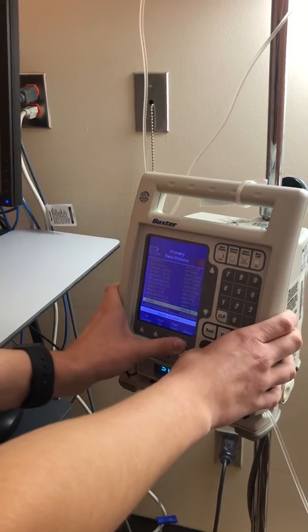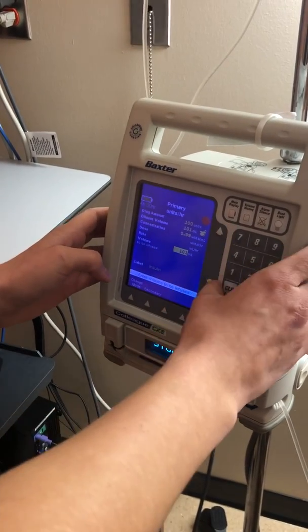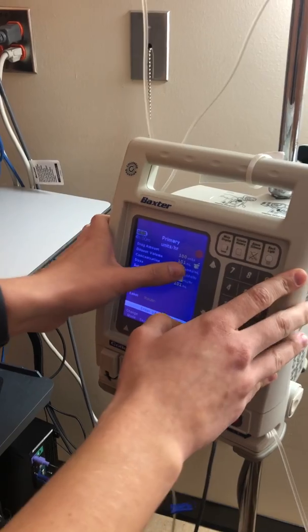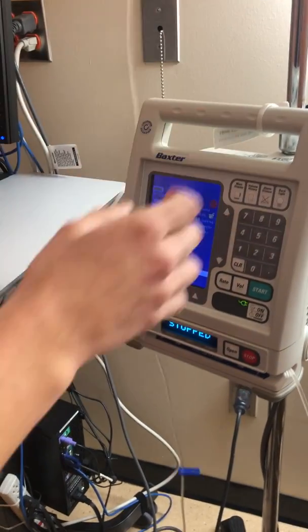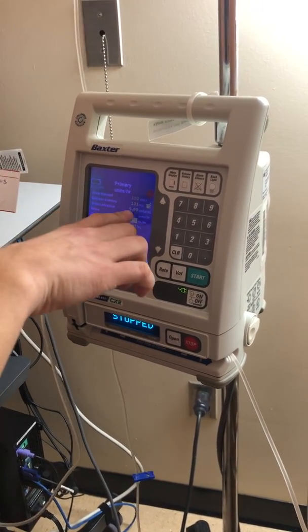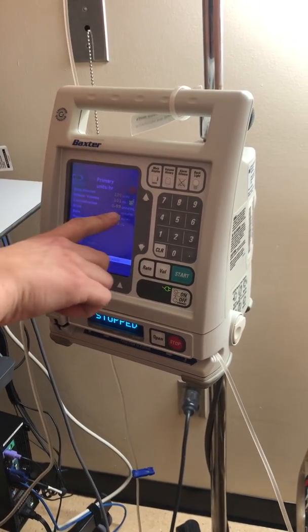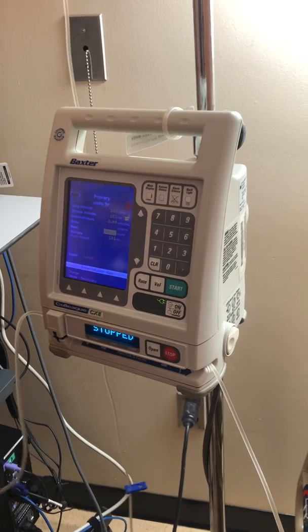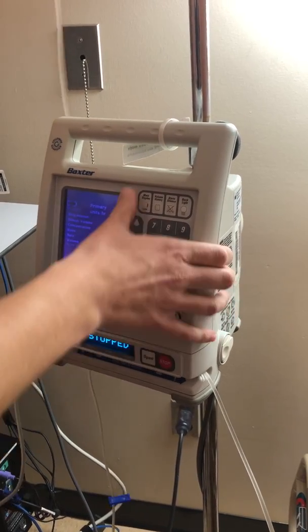Right here, so insulin, we're going to select that. So my line is labeled. So we have the drug amount is 100 units in 101 mLs. The concentration is 0.99 units per mL. The rate we want to do is 2 units per hour, so 2 mLs per hour.